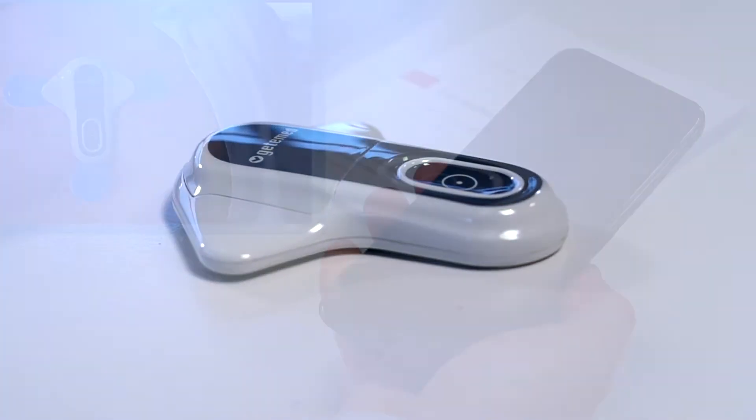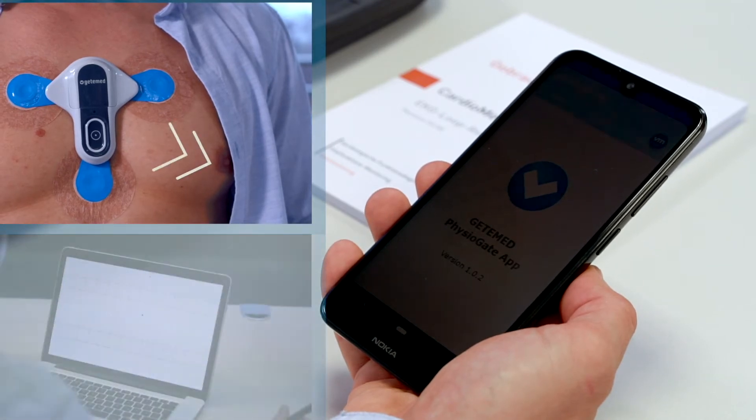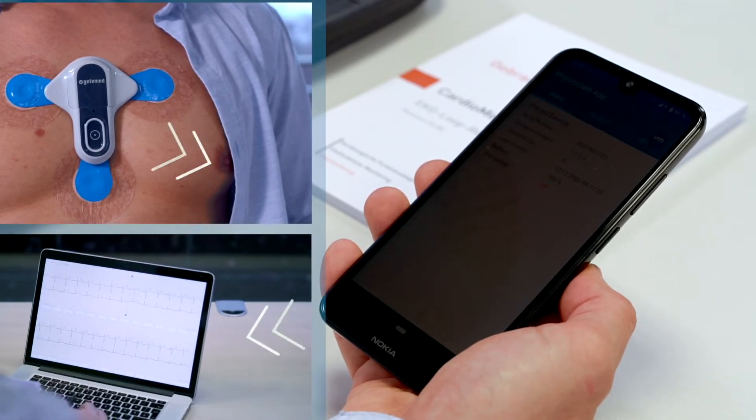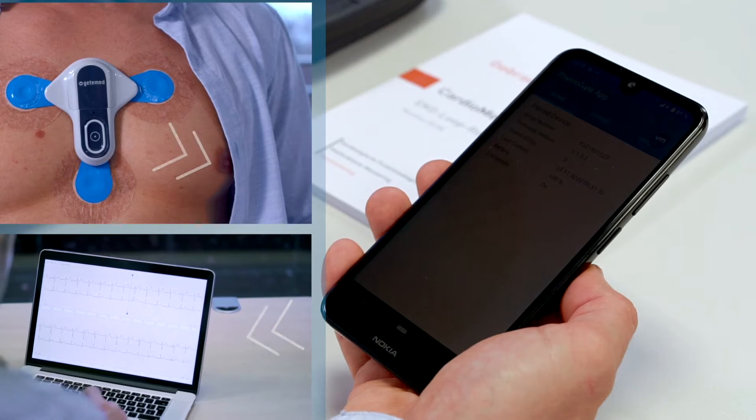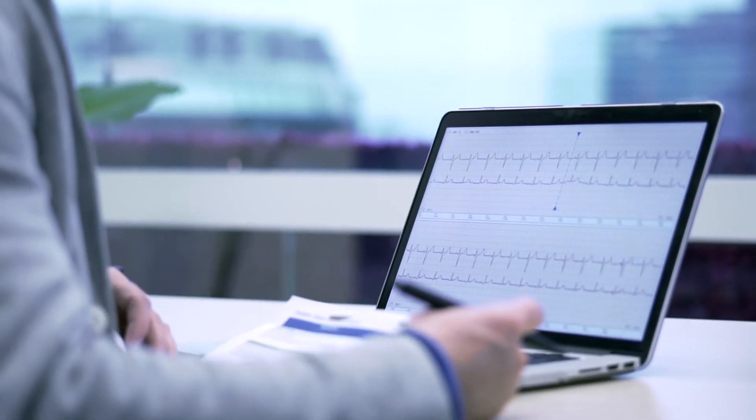The recorded ECG data are first transmitted via Bluetooth to the PhysioGate app on the smartphone, and from there forwarded to the final target address, usually to the doctor's practice, clinic, or telemedical service centre.